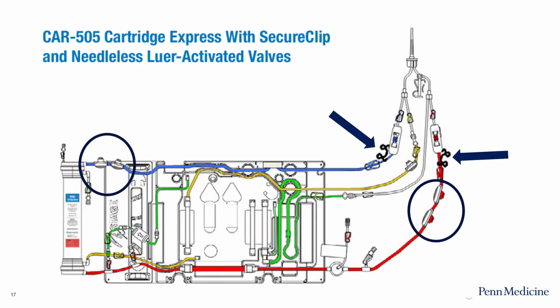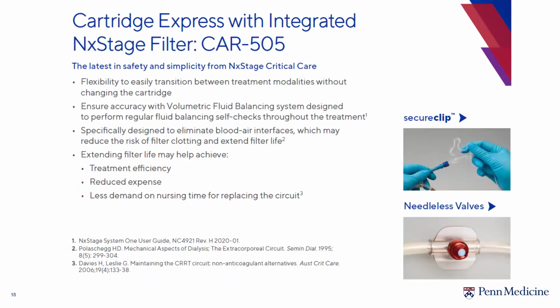There's also these clips, and these clips are actually designed to be more secure. They're secure clips is what the company calls them. And that just kind of prevents any accidental disconnecting of the line to the patient. And this is actually the tip sheet from the company showing you the secure clips and also the needleless valves.